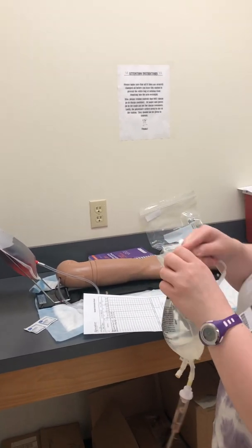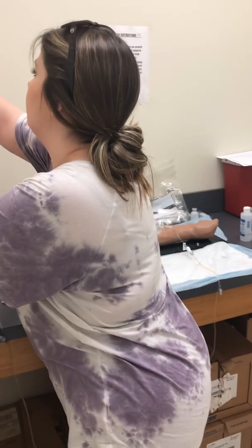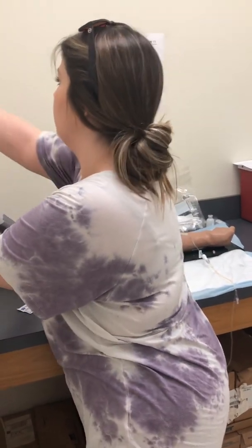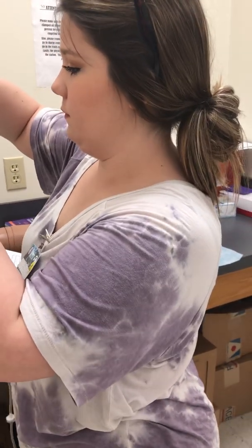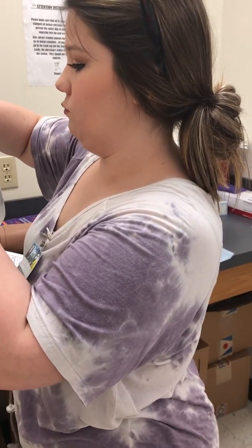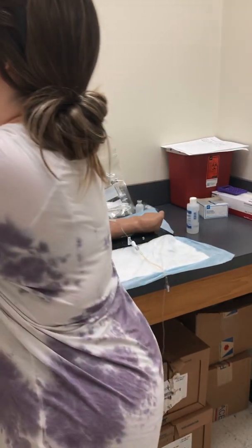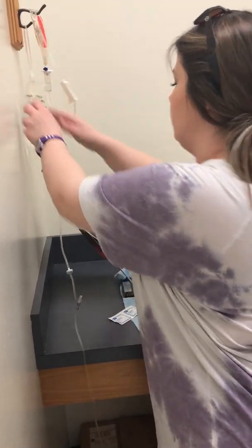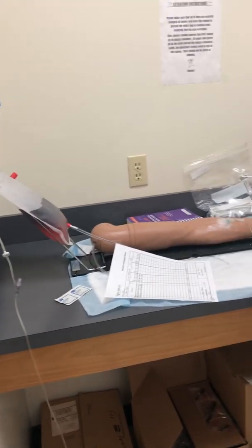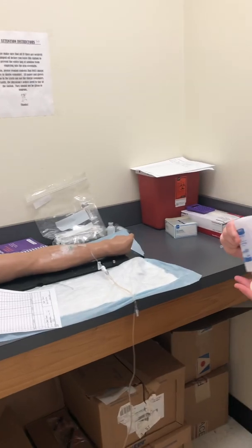Where's my time at? It's a little low. Okay, now that I've lowered the primary, I'm gonna wash my hands. I'm gonna wash my hands when I come in the room.